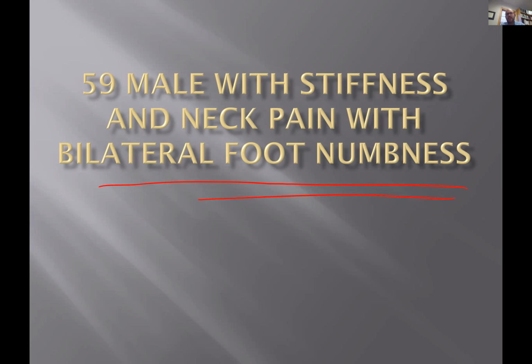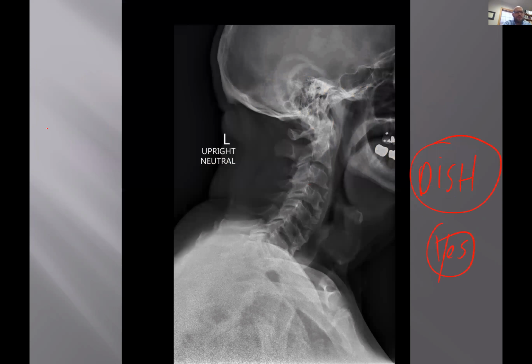All right. So what could be two causes of bilateral foot numbness in a patient with DISH that could be super important, a complication of DISH that could create that bilateral tingling in the feet? Stenosis or diabetes? Right. So good. So you can have not only ossification of the anterior longitudinal ligament, but you could have ossification like that of the posterior longitudinal ligament. And of course, that makes the canal about that big, which is no good. Now, in this case, I don't see any.